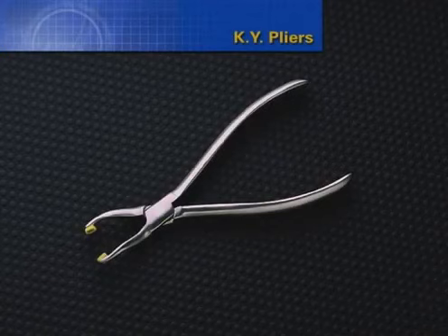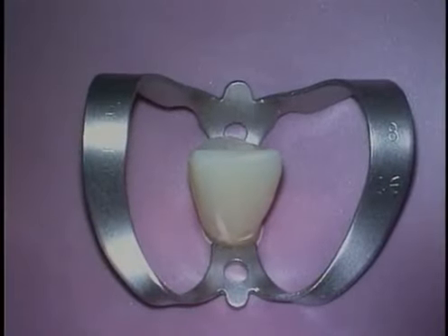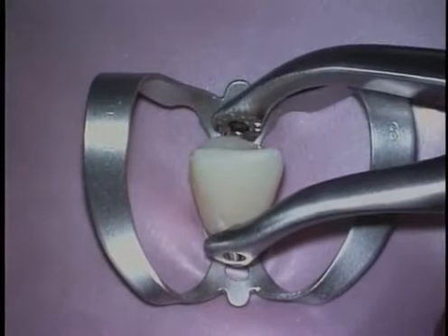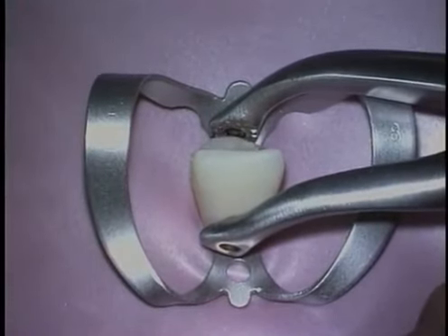KY pliers are excellent for removing provisional crowns and bridges that are temporarily cemented. The compressive jaws of the instrument have a waffled metal grid that provides a strong and stable grip for removing temporized resin crowns.